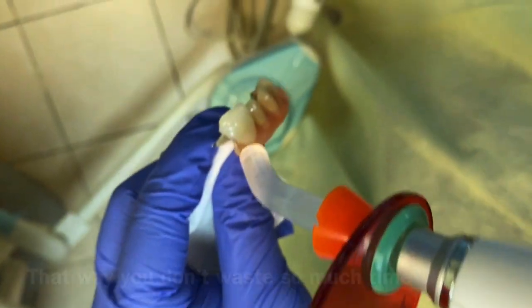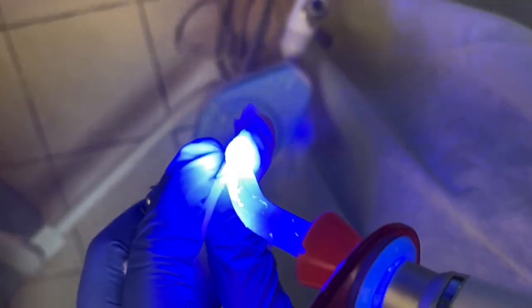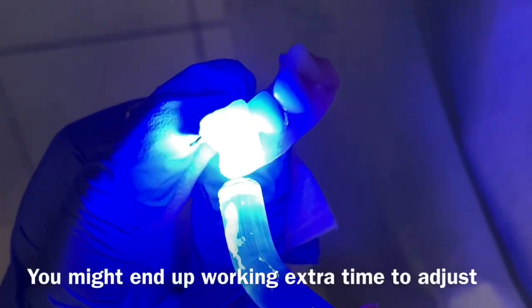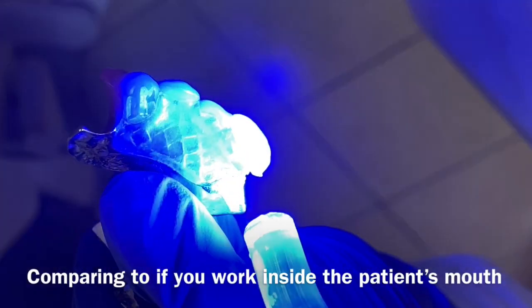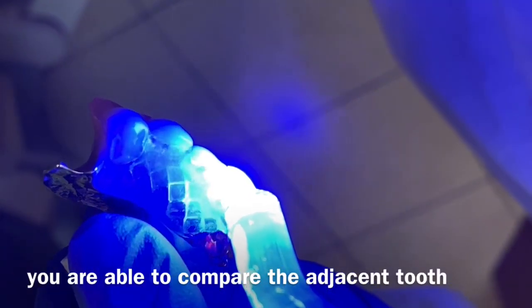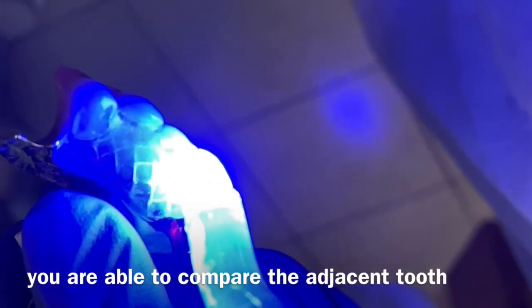That way you don't waste so much time. If you do this outside the mouth, the problem is you don't know the orientation of the adjacent tooth and you might end up working extra time. Compared to putting it inside the patient's mouth and working exactly like you build up a tooth with composite material.